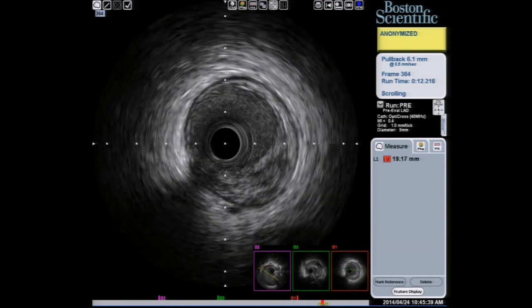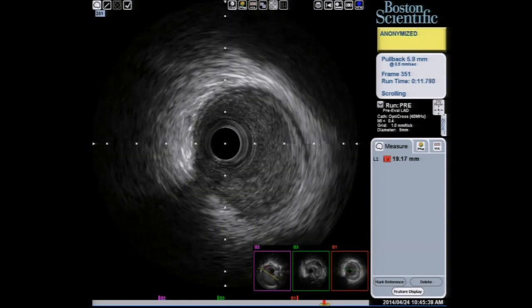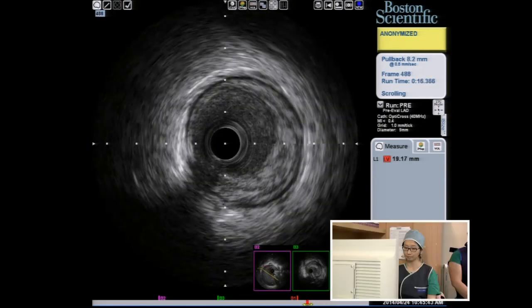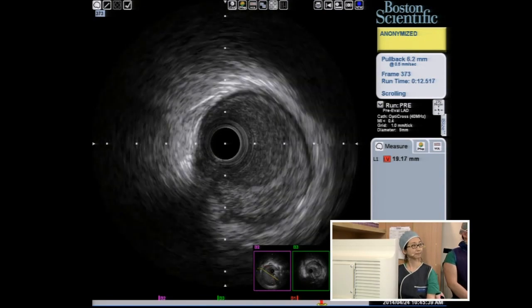Yes. And whenever you have ostial LAD disease, it's always important to note that it's extremely unlikely that you won't have some distal left main disease as well. And there is a small intermediate branch, which is not a vessel that you would want to stent, but you wouldn't want to lose it either. No, absolutely. We completely agree with that strategy.